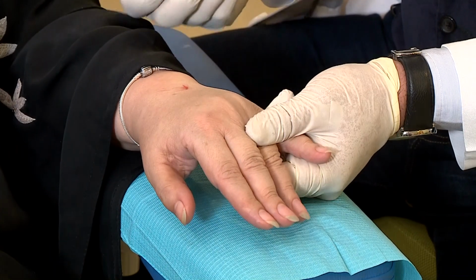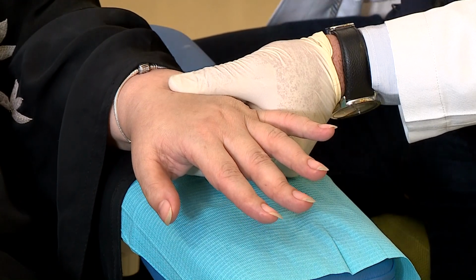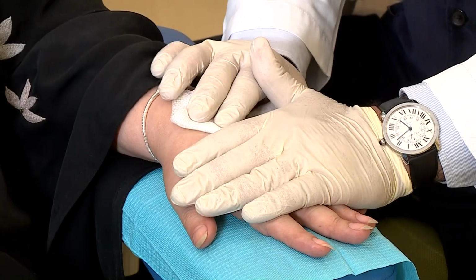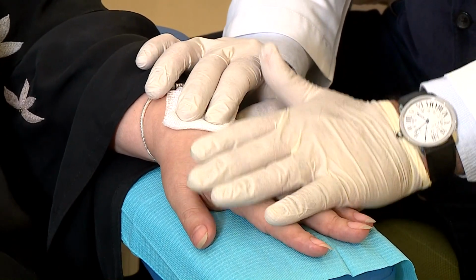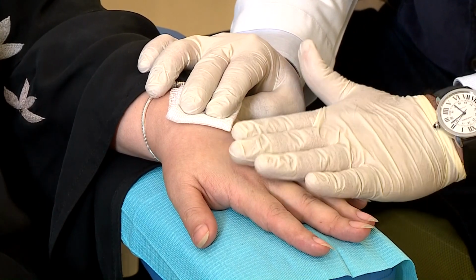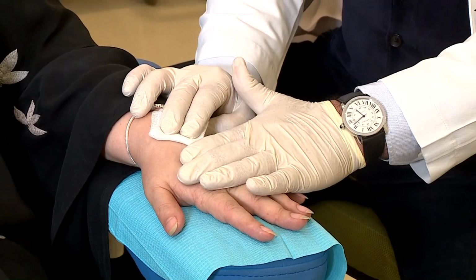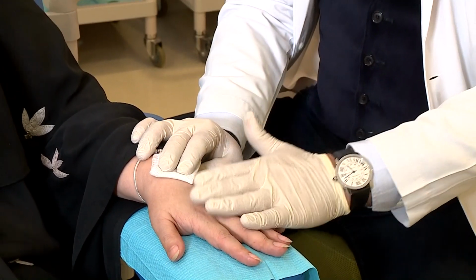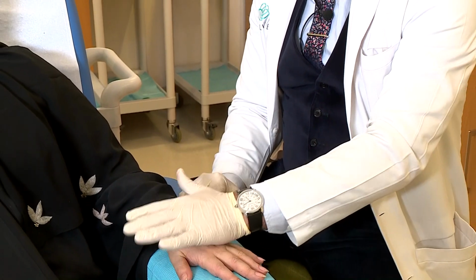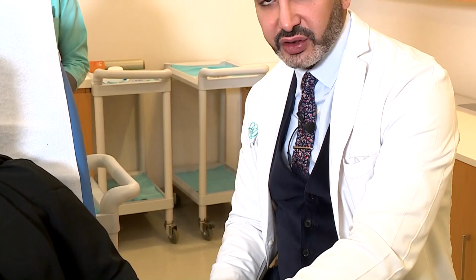Once you inject all your product, you apply a little bit of pressure. Ideally, you want to wait for the product to take the temperature of the body. The temperature of the body in the hands varies between 30 to 35 Celsius, and the product at room temperature will be around 20s. So you want either the patient to wait, or to put her hands in her body, or just to hold it and wait for the body temperature to take over the product.